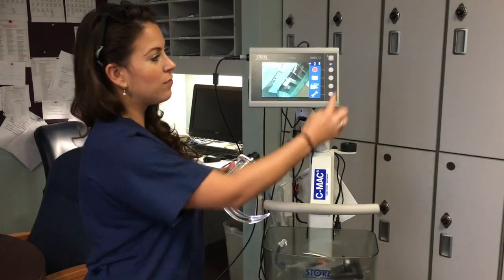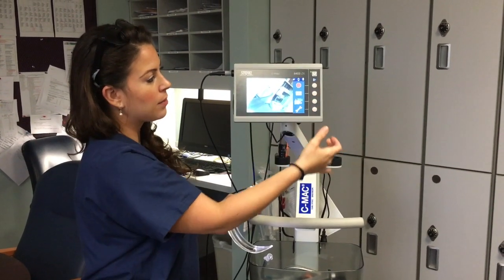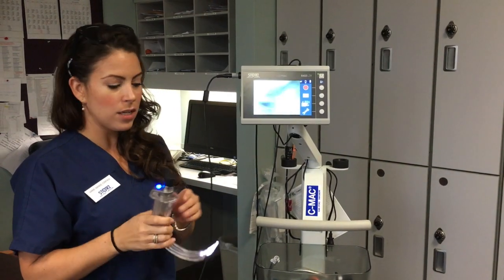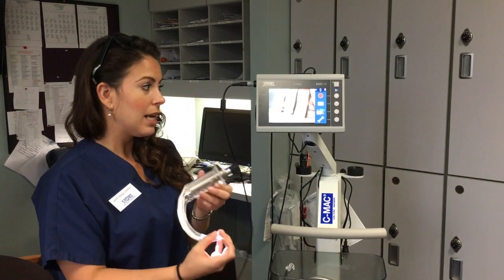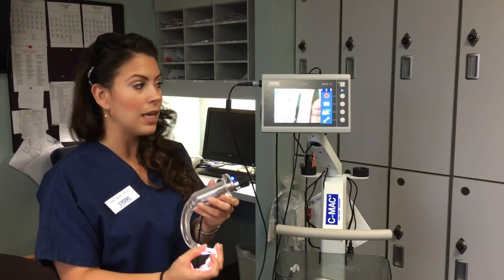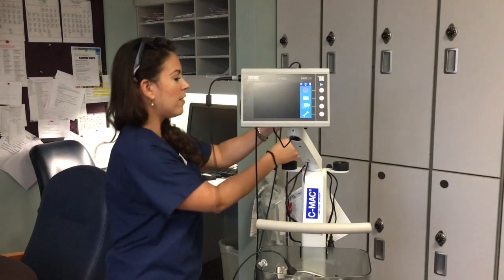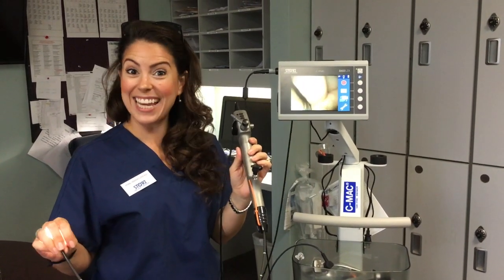You can also take pictures and video directly on the monitor. This button is video, this is pictures, and this button is your toggle button. So if a patient comes in, you intubate, it's an unexpected difficult airway and you can't get it with the blade — with the touch of a button, you now have a flexible video scope at your fingertips in seconds.